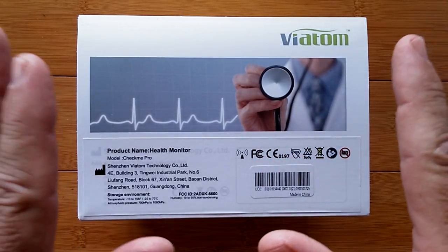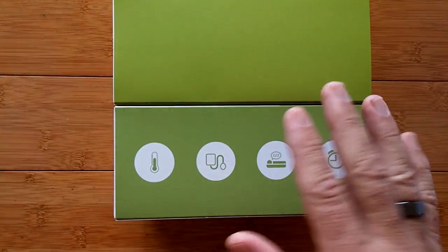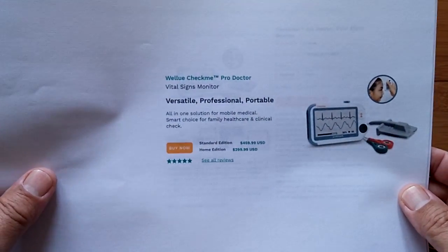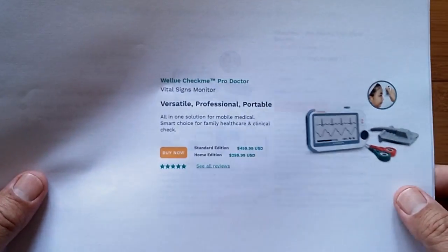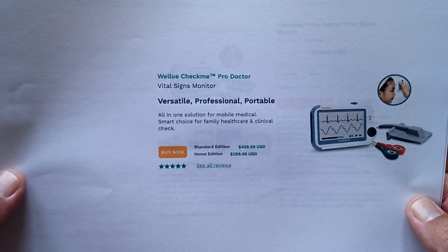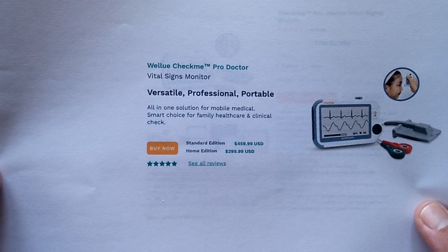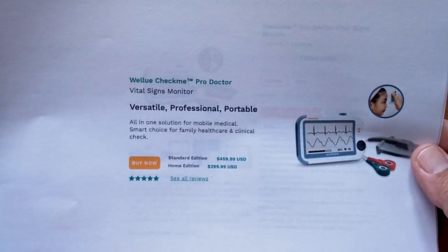Viatom is the company behind manufacturing this device, and it's being offered through Wellue. It's called the Wellue Checkme. It's the ProDoctor Vital Signs Monitor, and this was being made way before the coronavirus was even imagined, but it has turned out to be very valuable. Wellue indicated they've given 500 of these to first responders and triage centers to help with identification of basic vital signs for screening potential virus candidates.